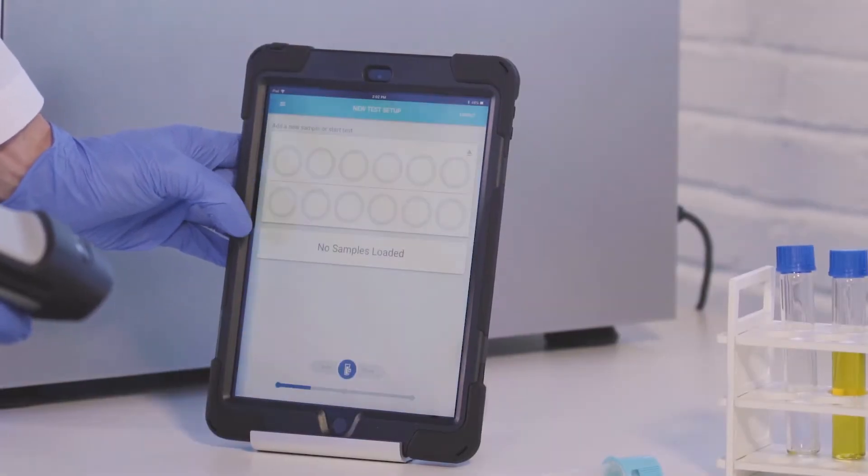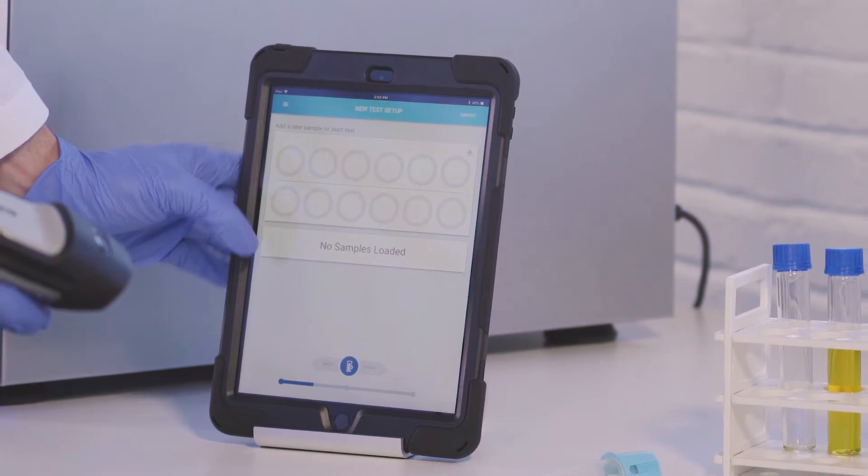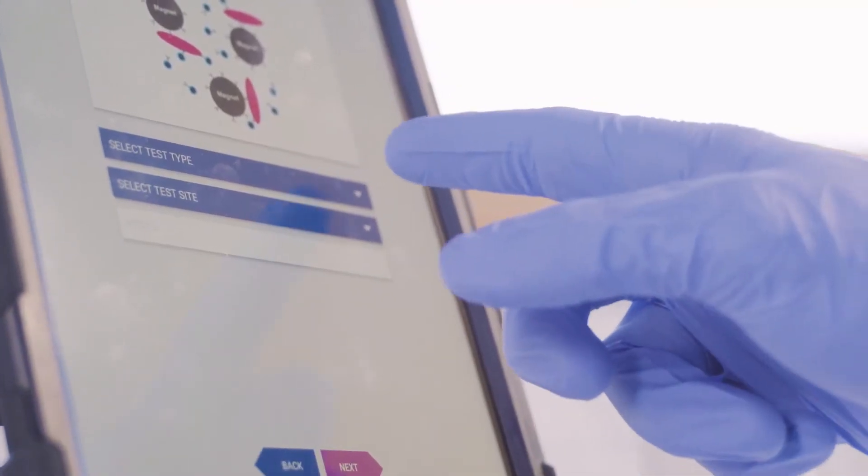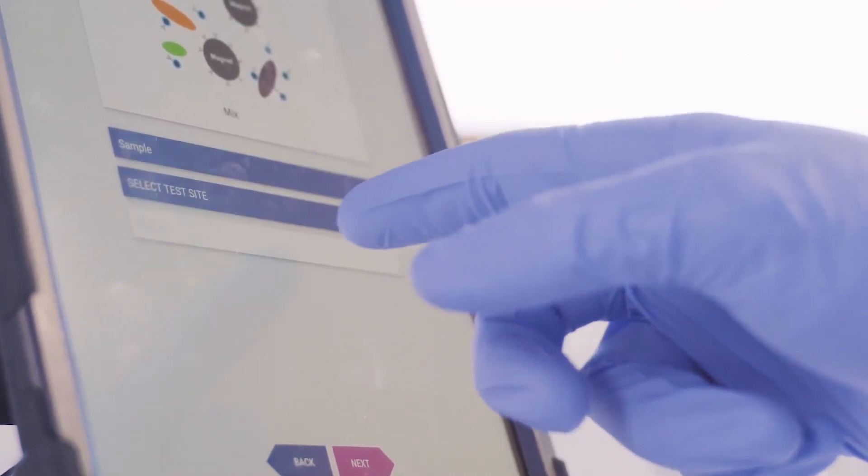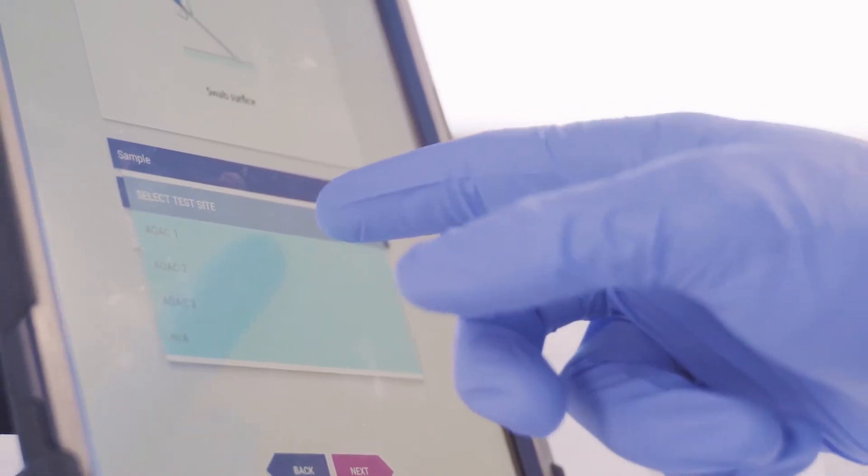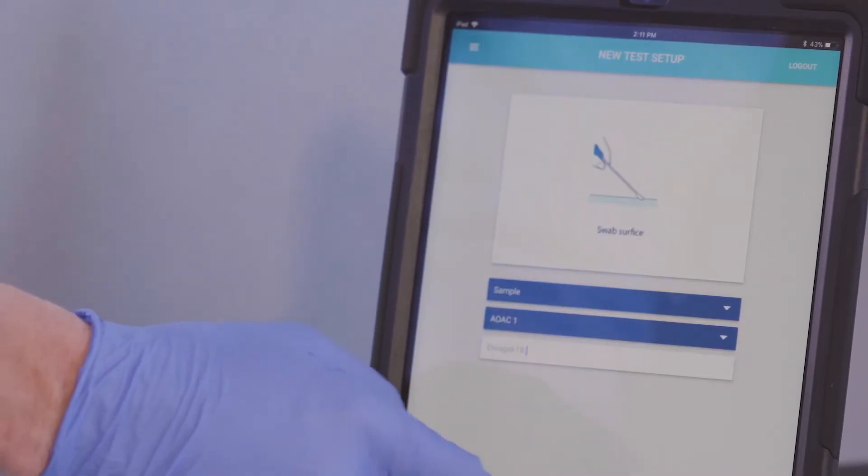With environmental samples locked and ready, use the control pad to start the test by simply clicking on New Test Setup. Next, select the type of test, the pre-programmed test site number and location.